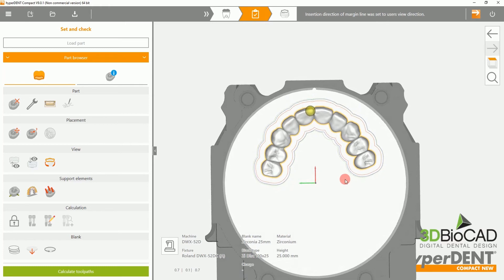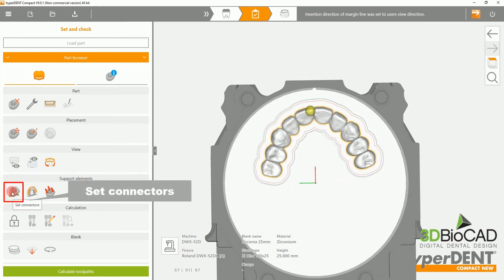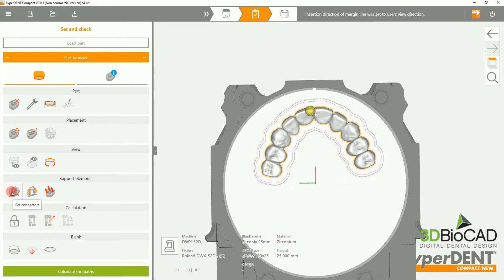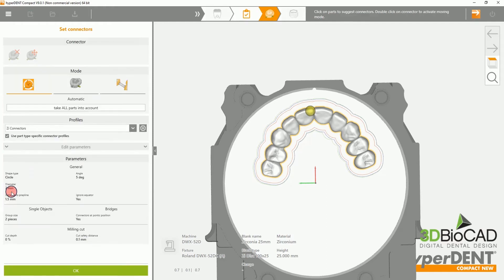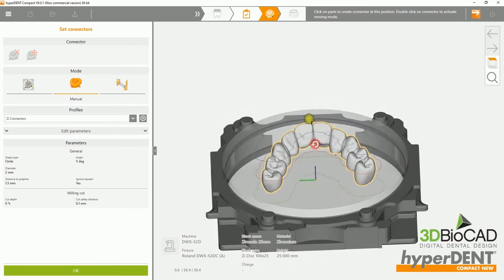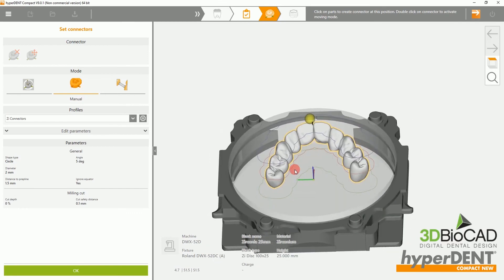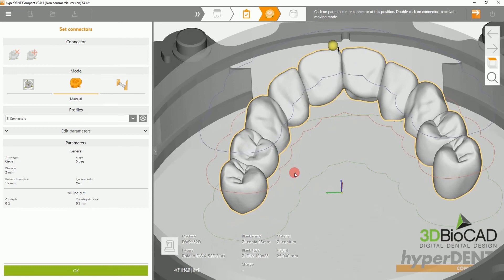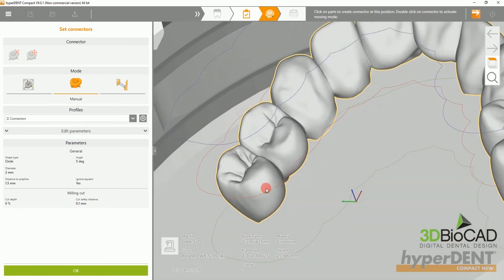After setting your insertion directions, you'll want to set your connectors. In this case, we'll be setting ours manually. Please zoom in and set your connectors onto the green line. You do this to minimize undercuts.